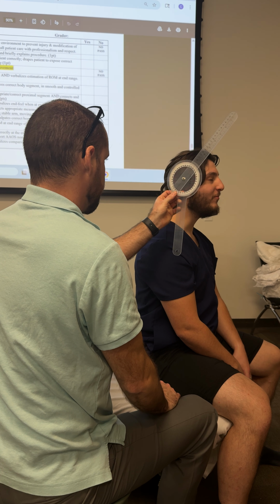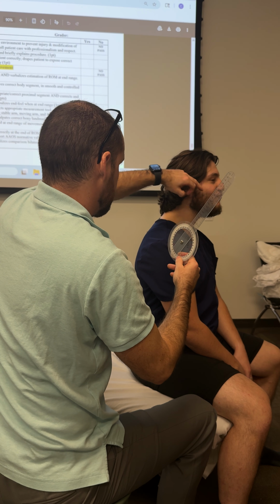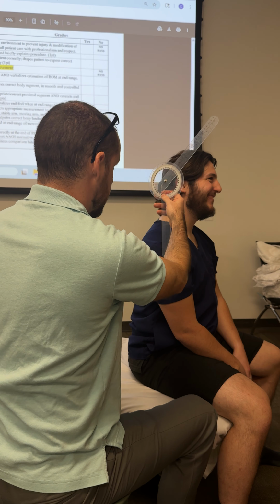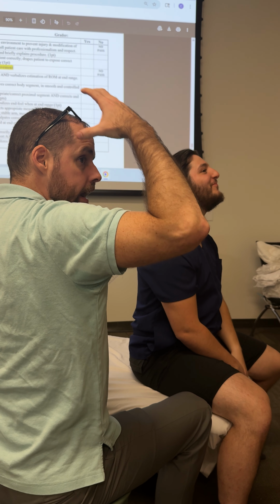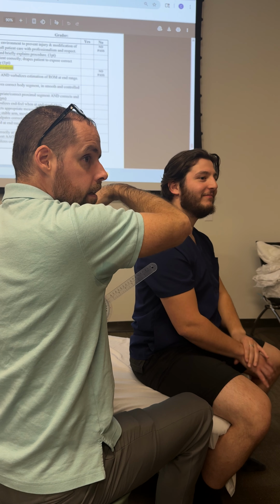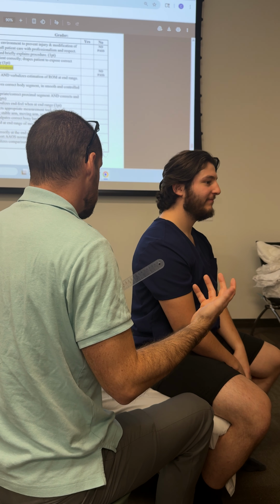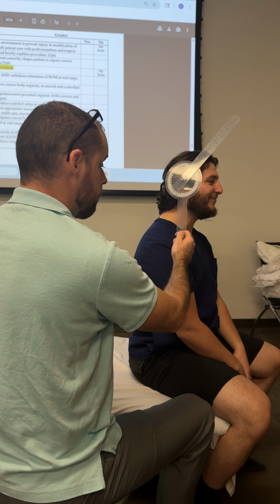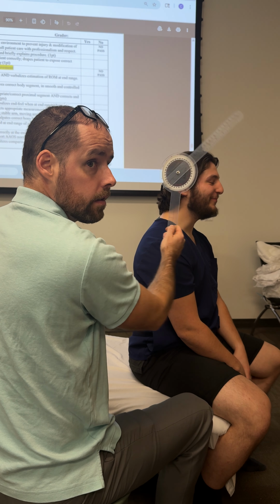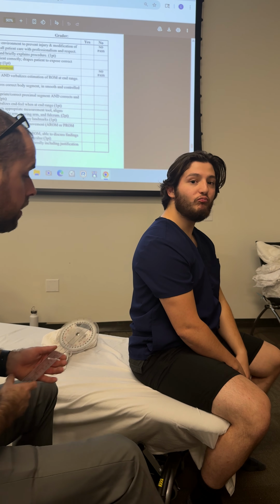I move my axis to stay in line. His long, beautiful hair is getting in the way, so I'm trying to look through it. Patients with long enough hair can use a hair tie or the man bun, if they want to get it out of the way, great. If not, just do your best. But as I'm moving this, I need to make sure my stationary arm is not moving at all. That's really the biggest thing, okay?